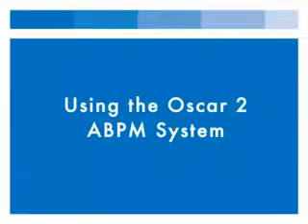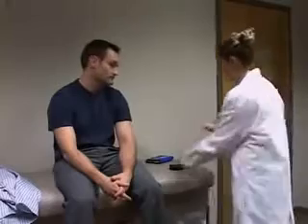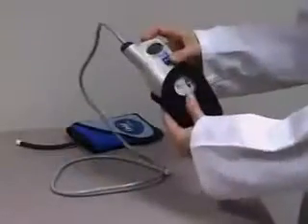This video demonstrates the proper patient setup for a 24-hour ambulatory blood pressure monitoring study with the Suntec Oscar II. Before you begin, be sure the patient understands the Oscar II is a medical device, not a home BP monitor. It should be worn for the duration of the study, both while awake and asleep.